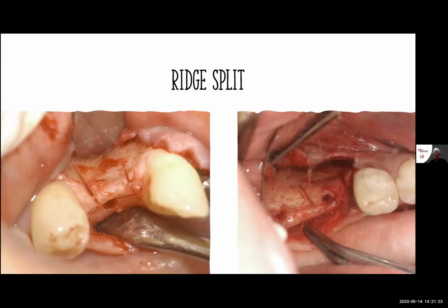It's a slow process of getting this bone to expand and to slowly move and to slowly position itself so that it will be in a lateral position. It is not a technique that you can do quickly, or else you will end up fracturing off these segments of the bone. And so I like to go slow with this particular technique itself.